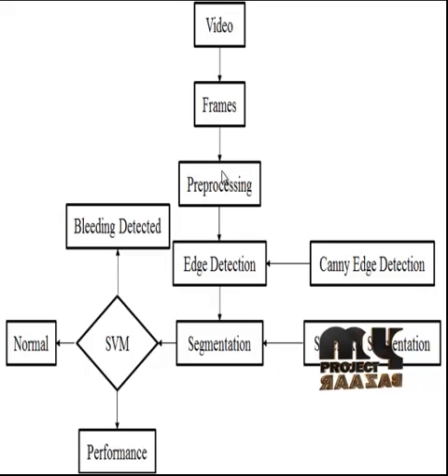In the pre-processing step, basic steps like filtering are employed. After that, the detection of edges is employed using the canny edge detection methodology. In this, the outlines of the affected regions are obtained. After that, segmentation is employed based on superpixel segmentation. During segmentation, thresholding based region initialization is employed. For each video frame, the threshold regions are defined.